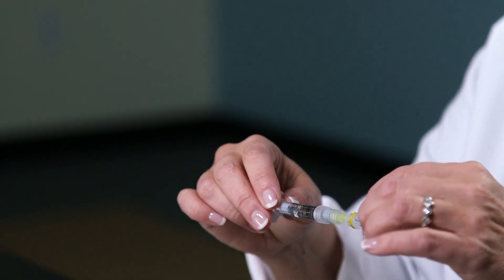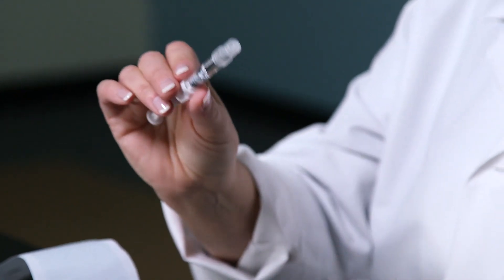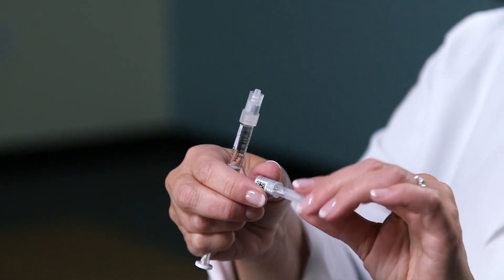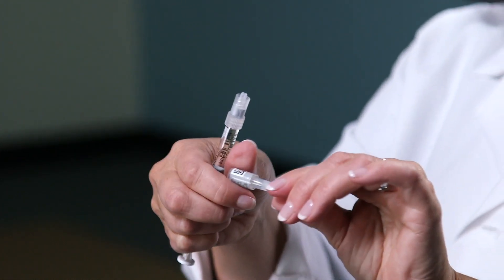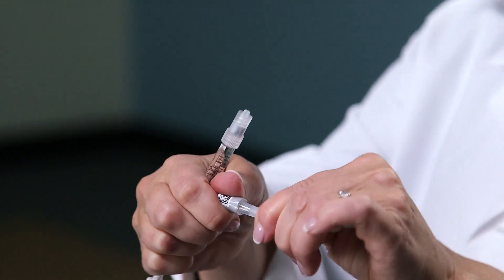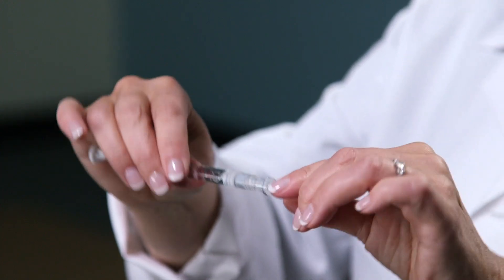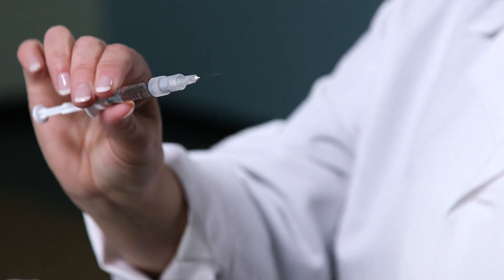Replace the cap carefully and untwist. Then do the same for the smaller needle — grasp it by the bottom of the cap and untwist the top. Screw the shorter needle into place.